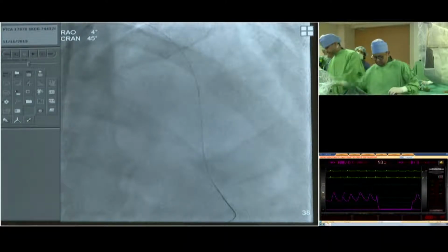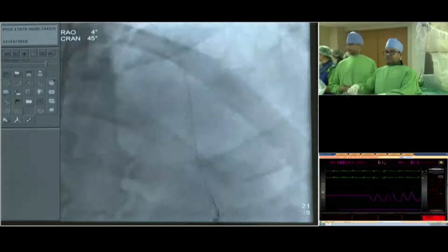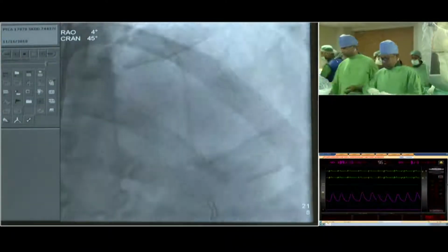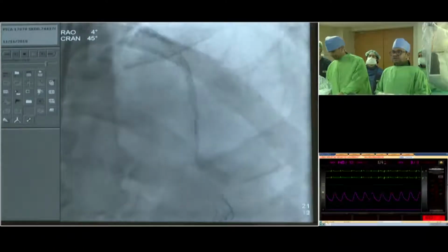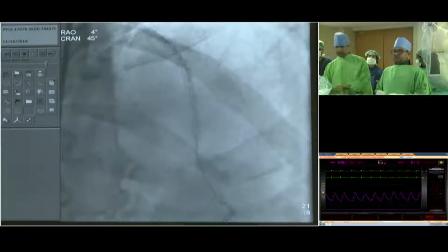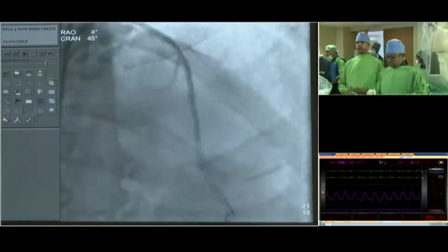Balloon should be ready. Beautiful. So this looks okay. The distal end is slightly oversized. So proximally we have to do more optimization. So can we have a 3 into 13? So we have mosaic balloon 3 into 13, NC please. As you know, we can go up to 0.5 millimeter quite easily for post dilatation. But in this case, the sizing looks good, and we have the imaging technology also. So we'll reconfirm it before going more than 0.25 size in this case.